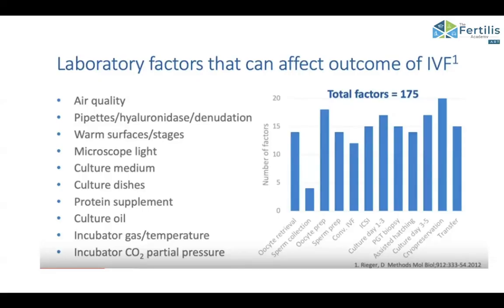And then the processes to be controlled: retrieval, sperm collection, oocyte preparation, sperm preparation, conventional IVF, ICSI. n number of variables are there in an IVF lab. So it is not that easy as it looks.